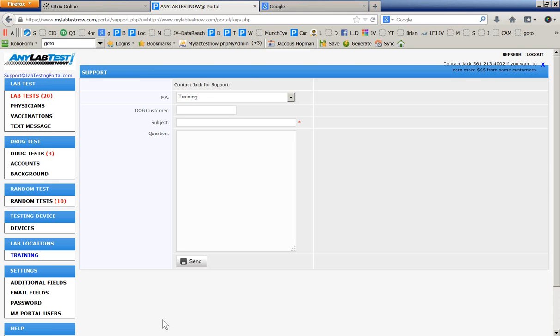So I got a comment back: I really enjoy having the portal. It makes life so much easier to go to one place to find the results in a few seconds. This is from Jacksonville. Thank you.